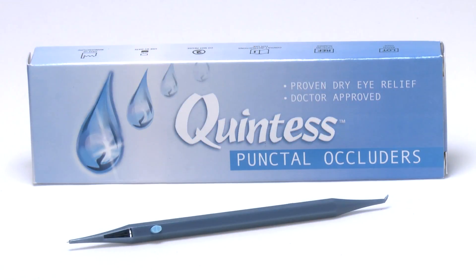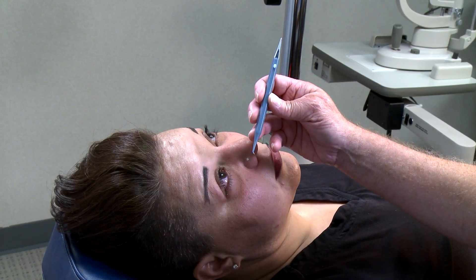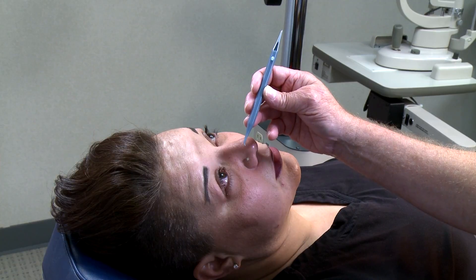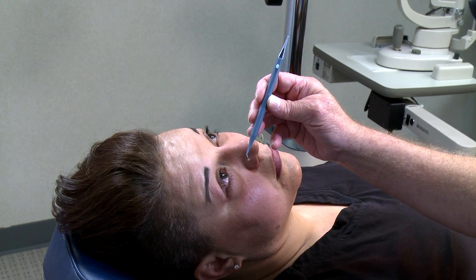Now I'd like to demonstrate how they're used. We've sized her for a small punctal plug. So we take the plug inserter — the plug is on this end, and on the alternate end is the dilator.